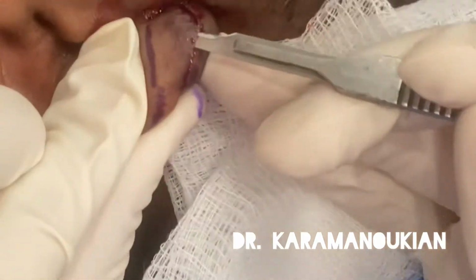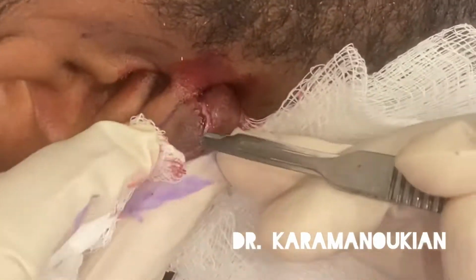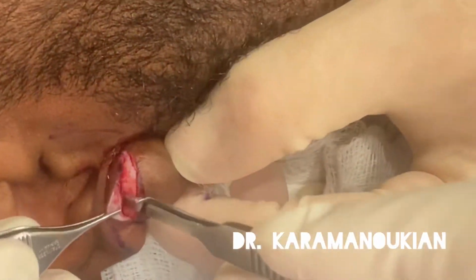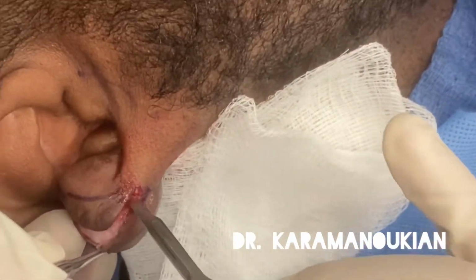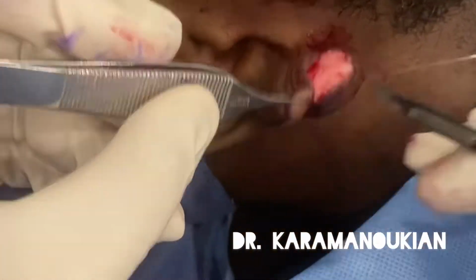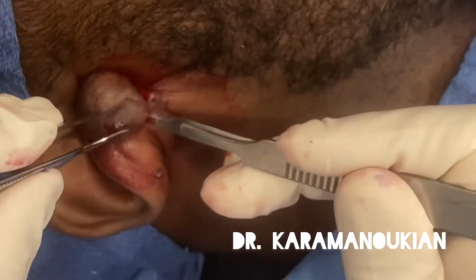preserve the skin. A 15 blade is used to make sharp dissections to separate the keloid from the overlying skin. This process is known as enucleation, which is quite different than the normal keloid excision technique. I use this technique preferentially, and I've written a paper on it, and I believe that it's superior to any other type of keloid surgery because it minimizes deformity after the operation.